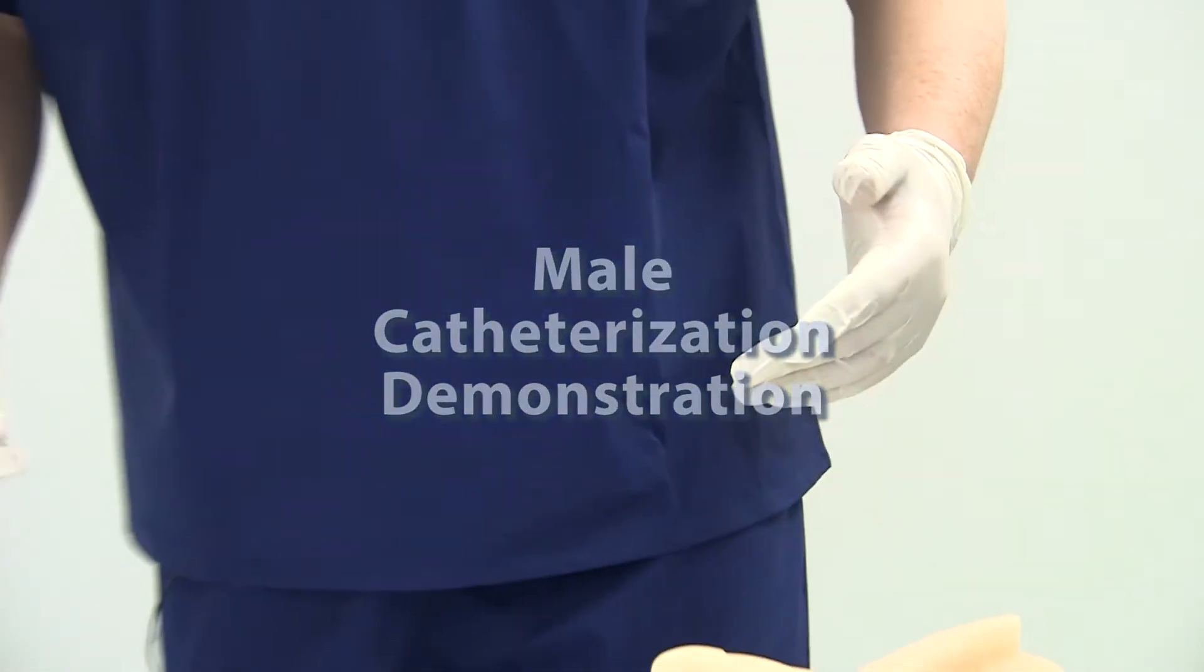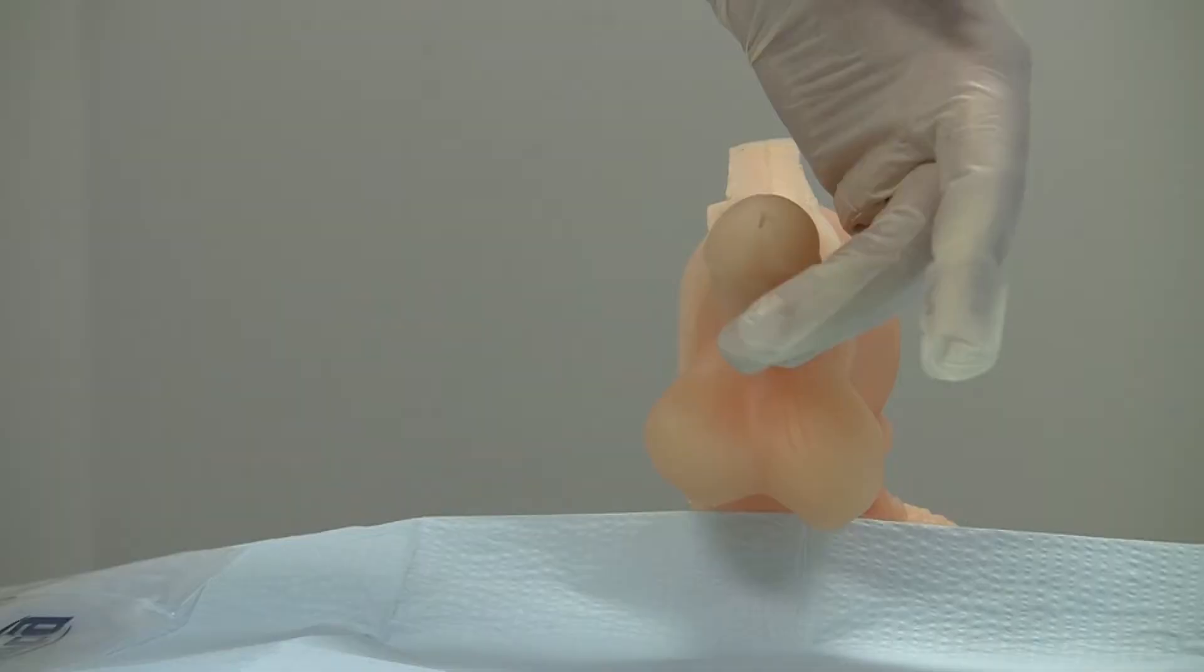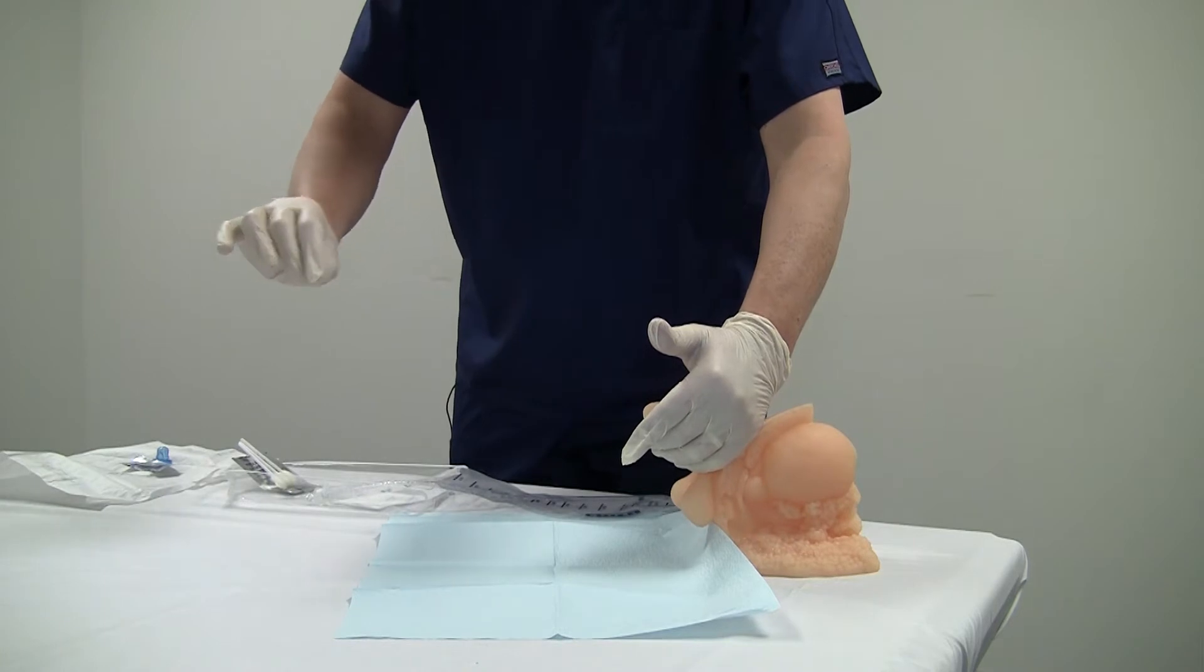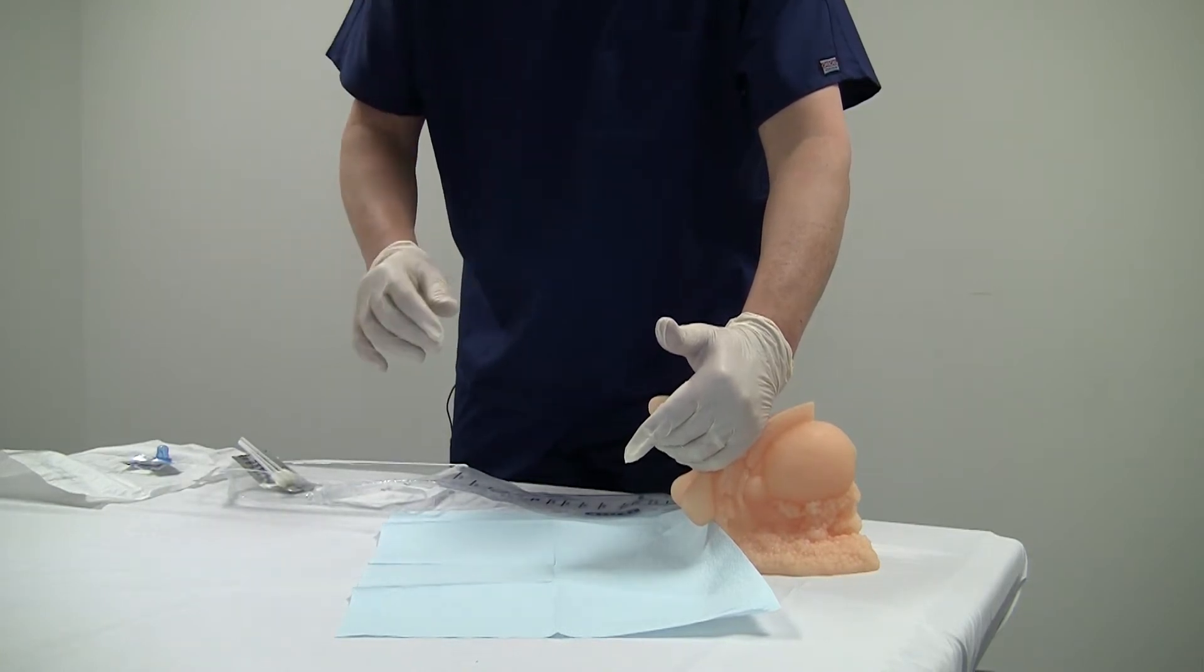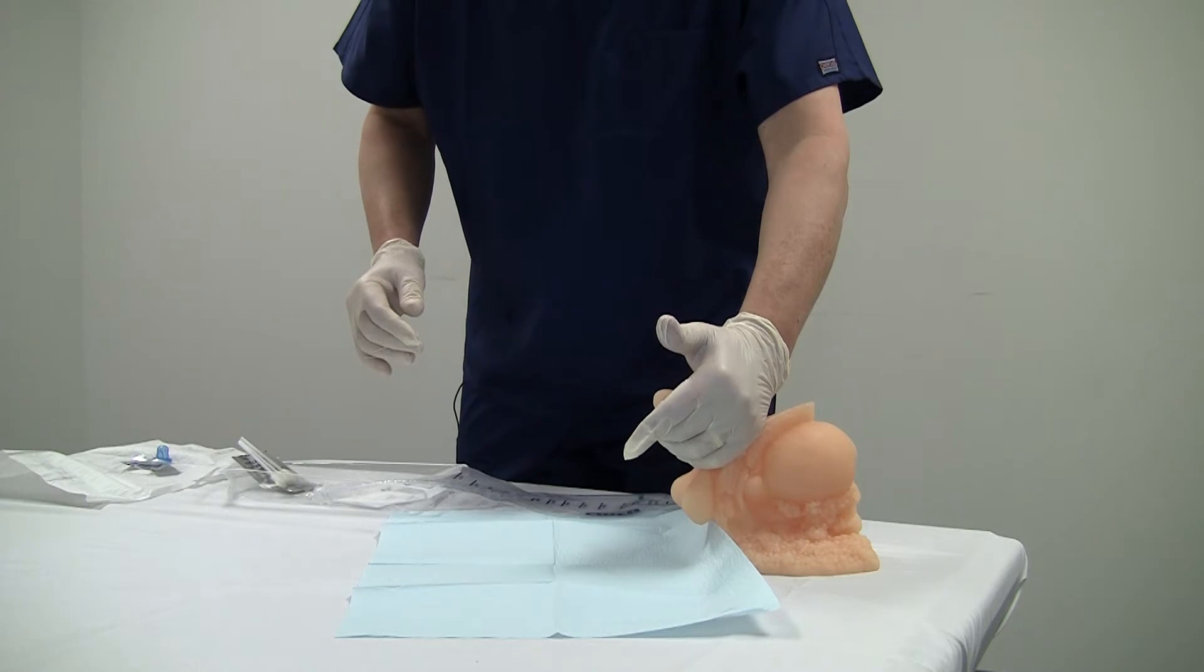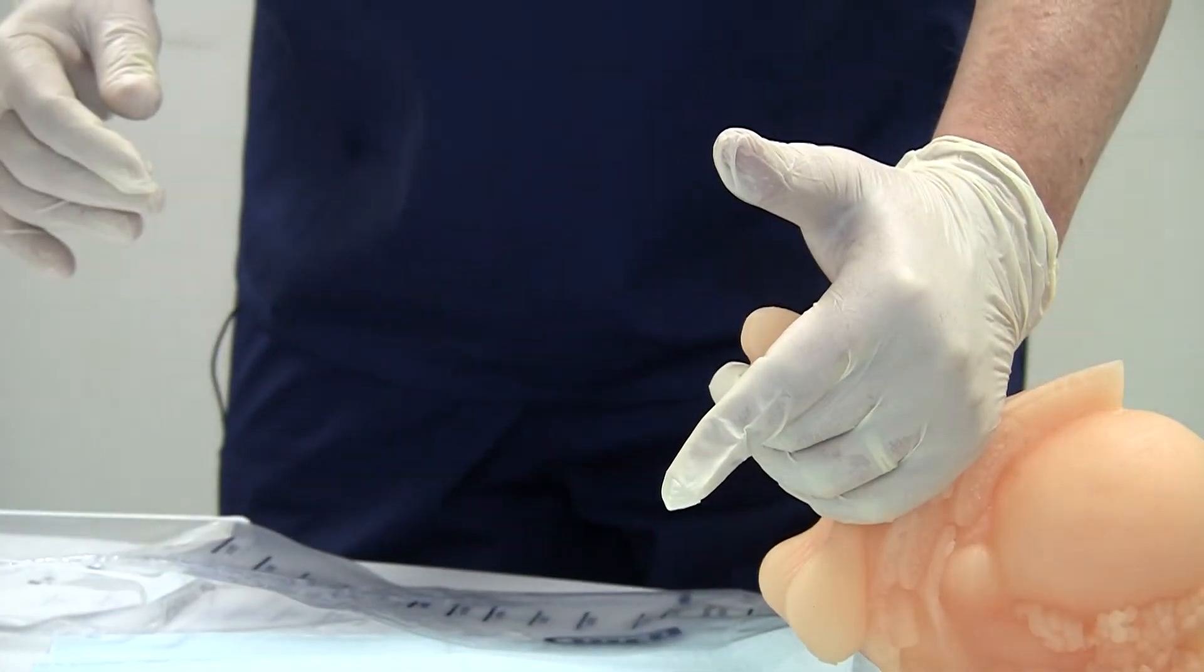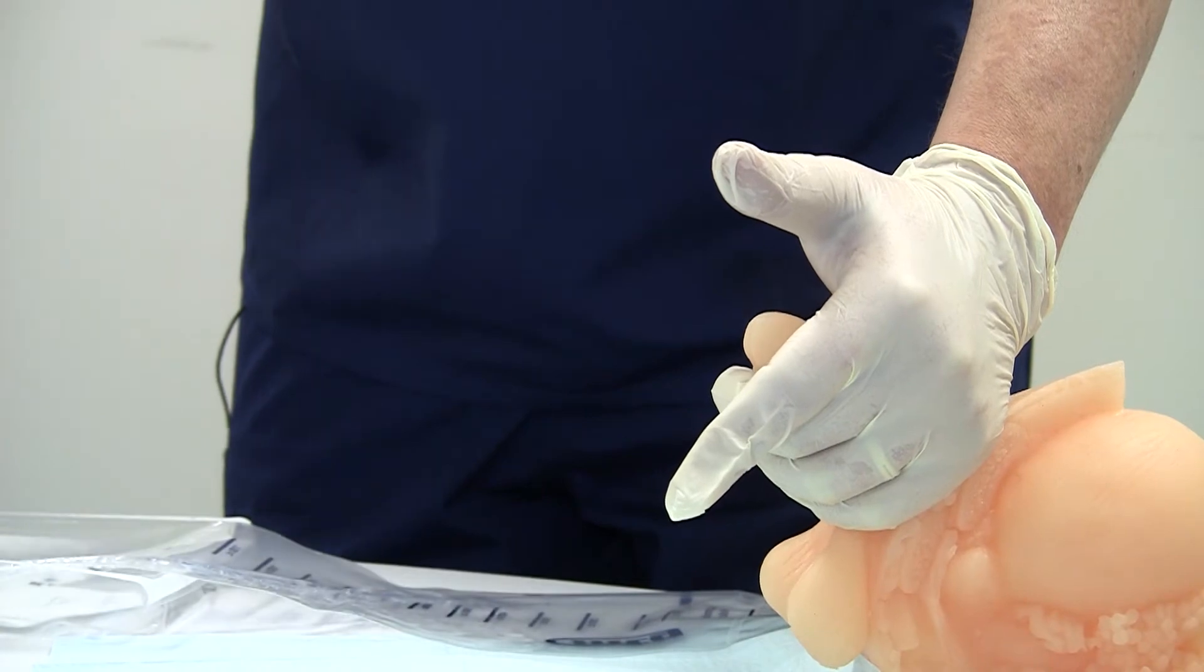The first thing I'm going to do is pull any foreskin back with my last three fingers of my left hand. I'm right-handed and all the advancement of the catheter will be done with my right hand. I'm going to use the left hand to stabilize the penis. Notice here that I'm freeing up my thumb and my index finger and I'll explain what they're going to be used for in just a second.